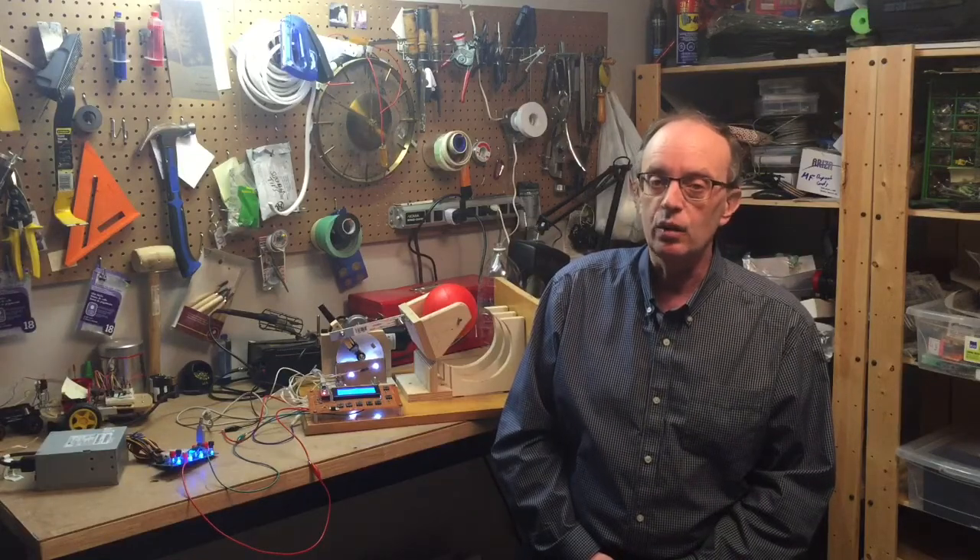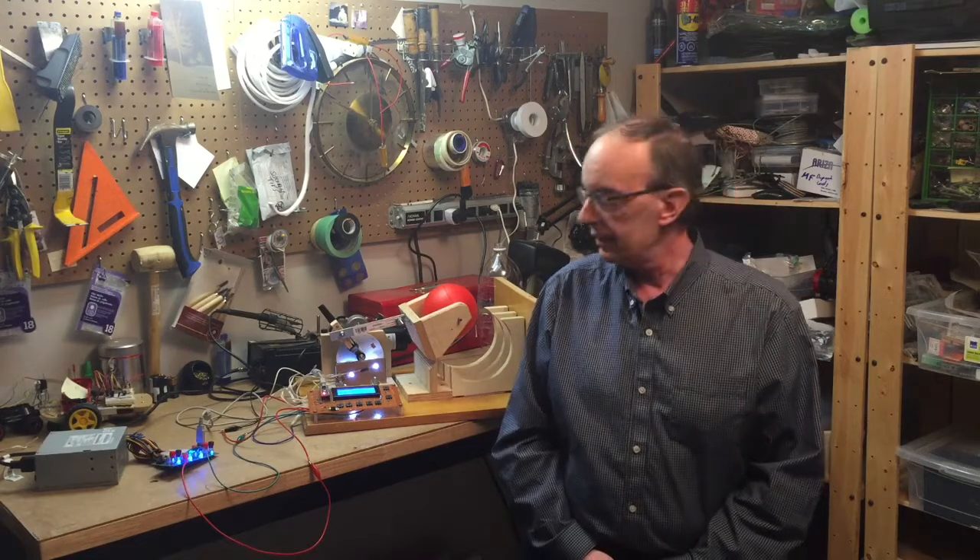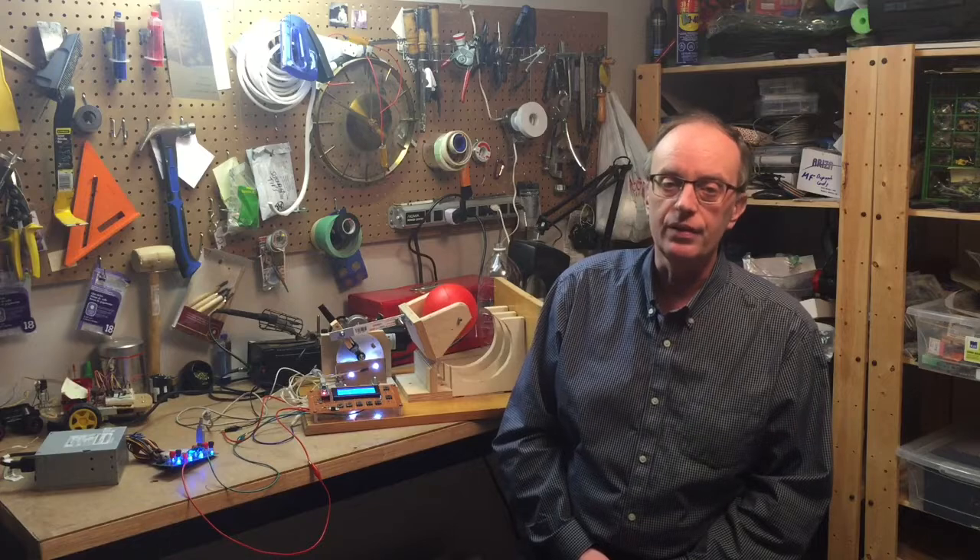Hi, I'm Gord Payne from Newmarket, Ontario, Canada. There are 12 million people in South Sudan and only four ventilators. This is my design for an inexpensive ventilator that can be built for under $50 US.